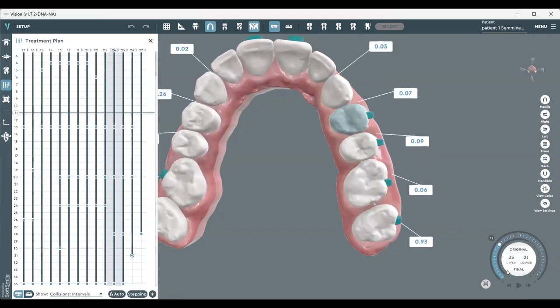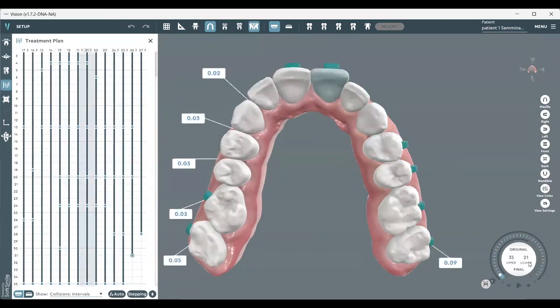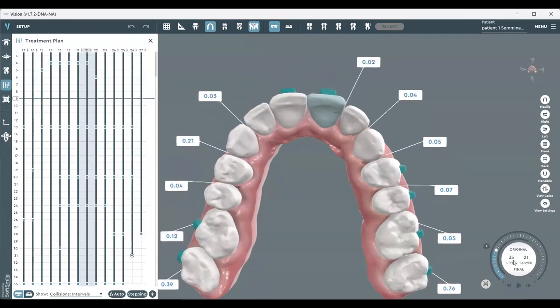What happens with the anteriors? Well, it's important to understand that the anteriors are the things that the patients see. They don't see the posteriors. They feel the bite change, but they cannot see it. There are open spaces in the posterior area, but they don't feel like something is happening. So it's very important to start with something that we call an aesthetic start, trying to improve the alignment of the anteriors a little in the first step, so they can see results from the beginning and engage with the treatment plan from the beginning.